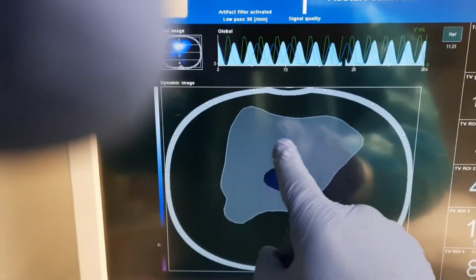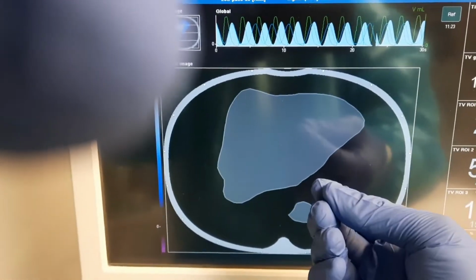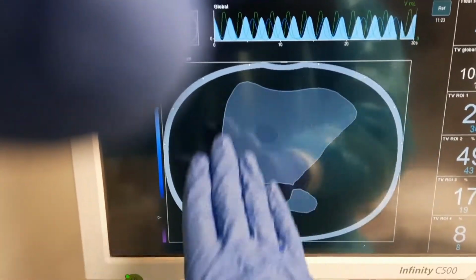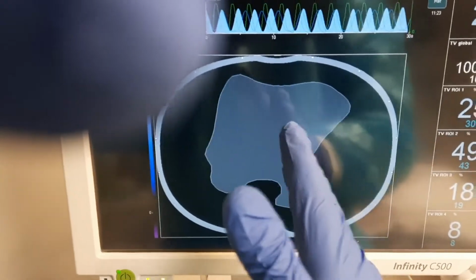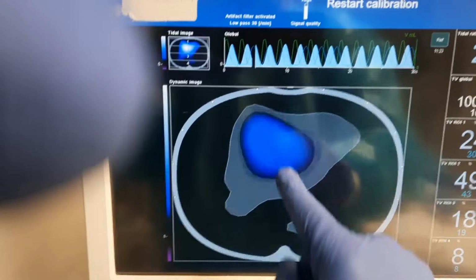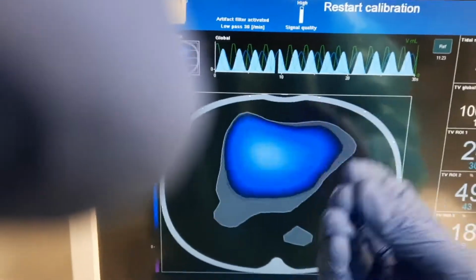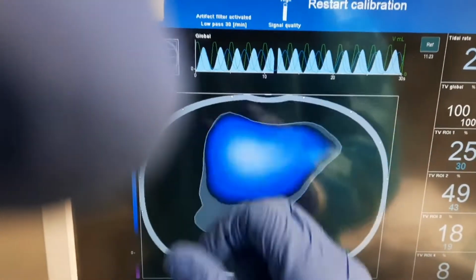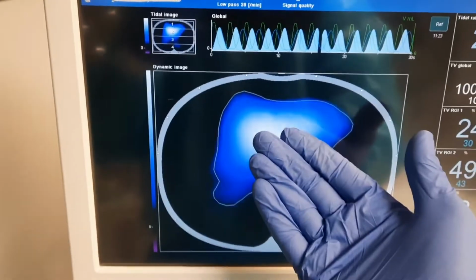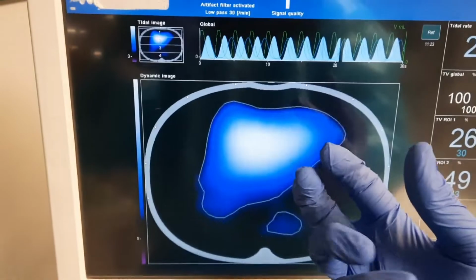We look at the white section here, which shows the maximum distribution of ventilation to that area, and we want that white area to be well spread out. It's a quick way of looking at evenness of distribution. If it's well distributed, the white inside the blue, that's good. If there's areas where there's more white intensity, it's telling us clinically that more of the ventilation, more of the alveoli in that section are taking the brunt of the ventilatory power.